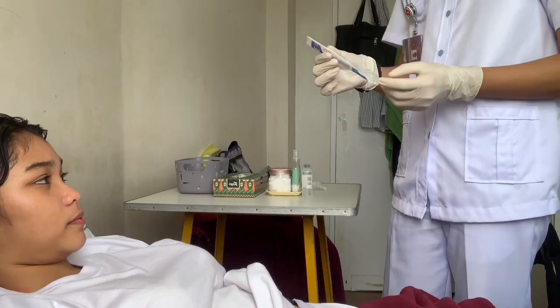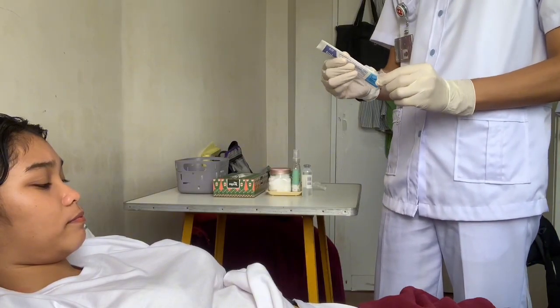Now I have here the syringe. Make sure that the connection isn't loose before.